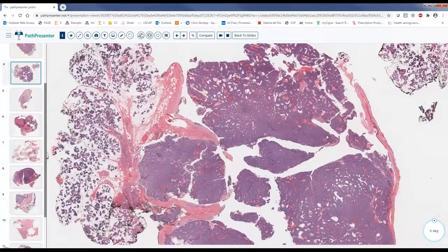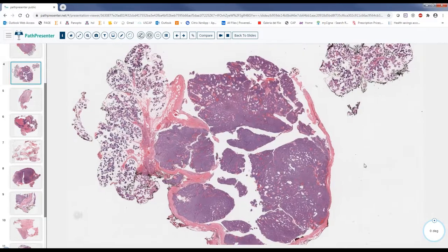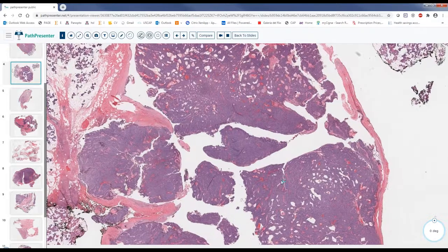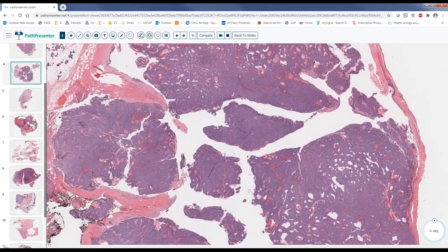And this is the lesion. Now we go to the lesion. Well circumscribed or not? Yes, it's very well circumscribed. That can be helpful in this lesion, but you can have similar appearances, especially if you are dealing with core needle biopsies. Is it homogeneous or not? Overall, they look alike. So what is the color, pink or blue? Yes, excellent. These are the things that you keep in mind.